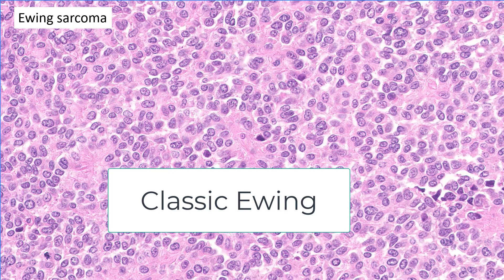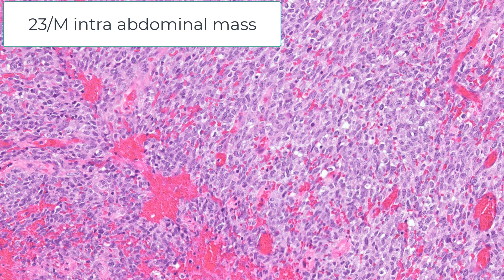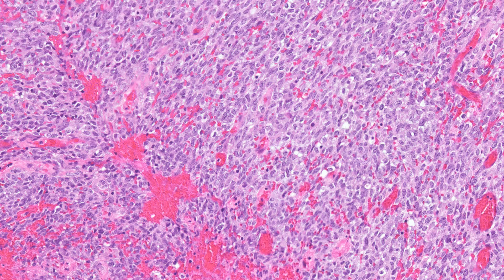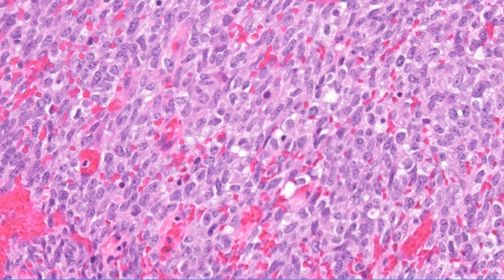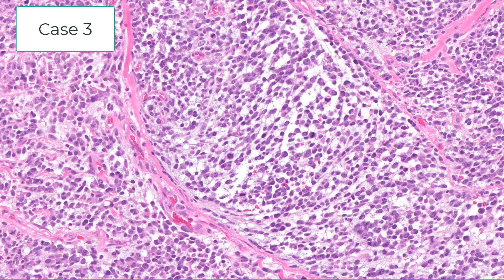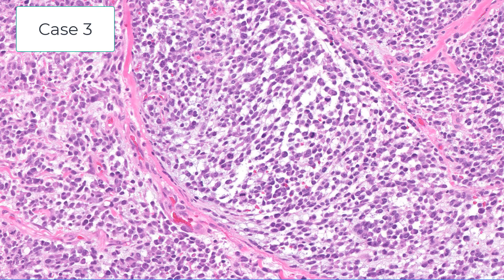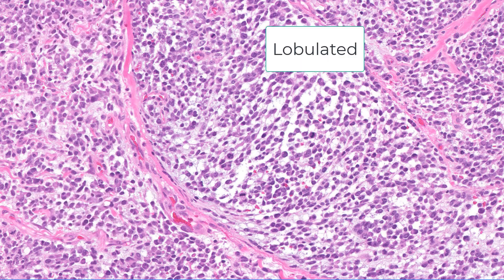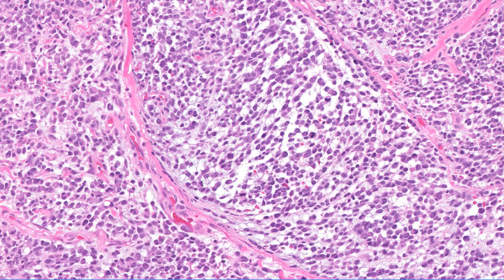By comparison, here is classic Ewing's. The next case was a 23-year-old male with an intra-abdominal mass — the cells are fairly spindled with vesicular nuclei and little prominent nucleoli. A third case has a slightly myxoid character with plasma cytoid-appearing cells in a lobulated pattern. All three of these cases are CIC-rearranged sarcomas, which tend to have atypical morphology and a rather lobulated phenotype with a bubbly myxoid background and oval cells with little prominent nucleoli.